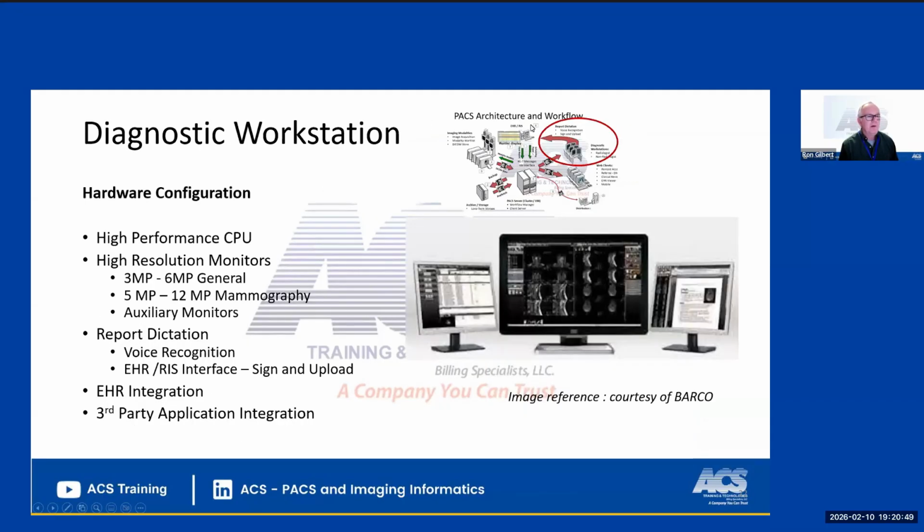And then I'll look at another part. Here's that diagram I just showed you, by the way. Now let's look at the workstations. I just showed you the server core. Now we're going to look at the workstations. We're going to be making the radiologist able to read, but it's going to be very automated and very integrated. They sign on the workstation and then it signs on everything else.